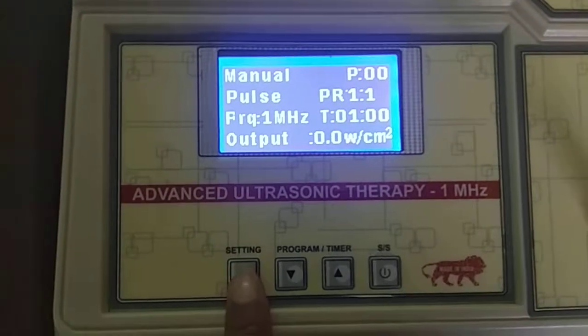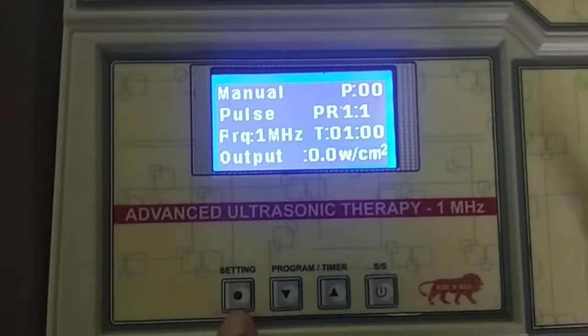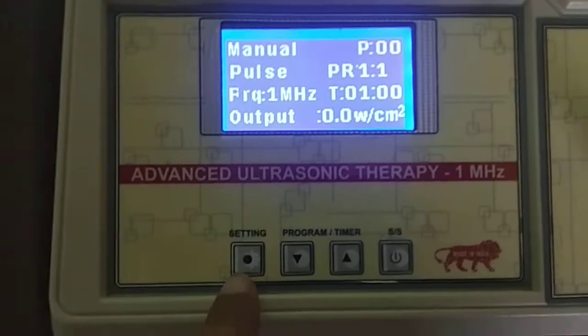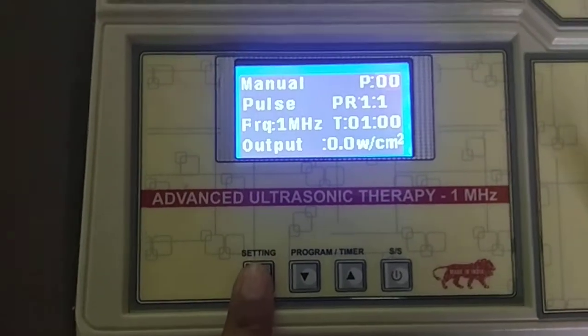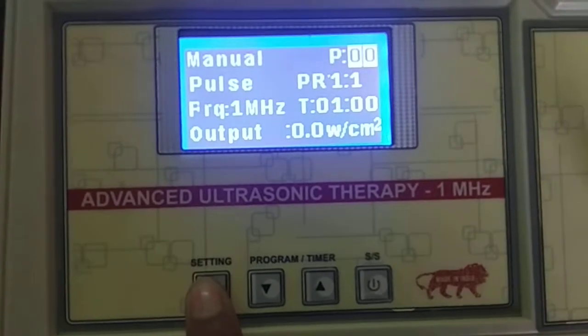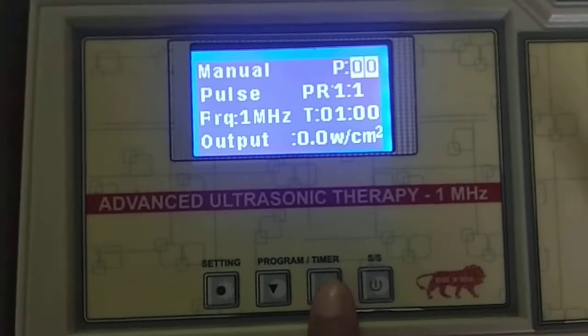Now I am going to show you the Programs mode. By pressing the Setting key you can choose the mode. Now the cursor is on Programs mode and I am choosing programs.